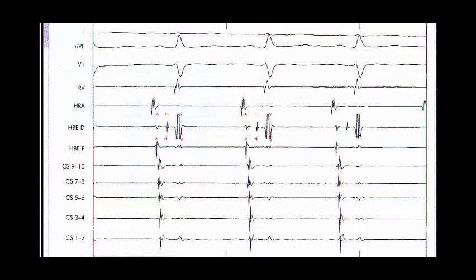When I do a study, all I do is study the conduction that's occurring in the heart during rest, at normal rest, and with pacing. Why do I do pacing? I do pacing from different locations. I do pacing from the ventricle, I do pacing from the atrium, and the target of my pacing is to detect the pathway of conduction.